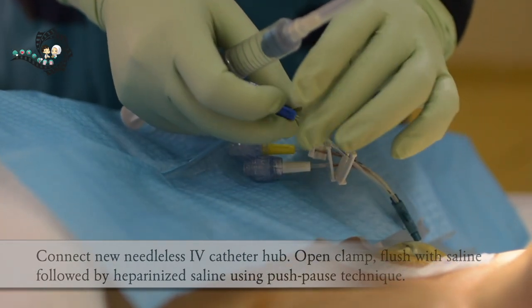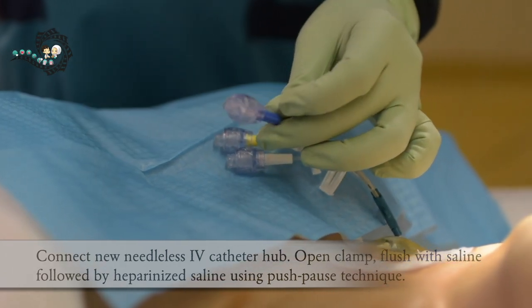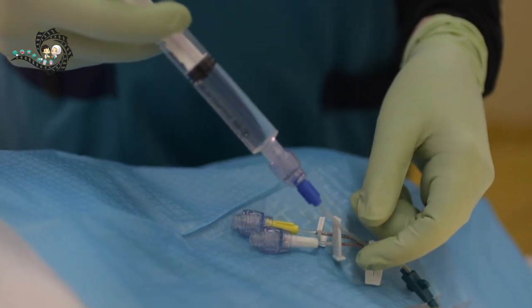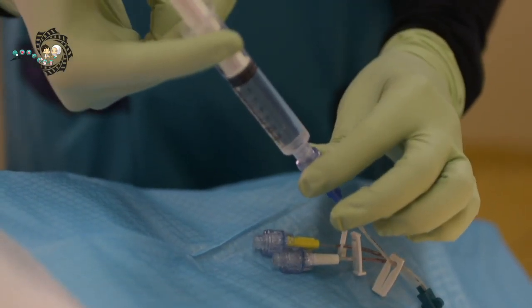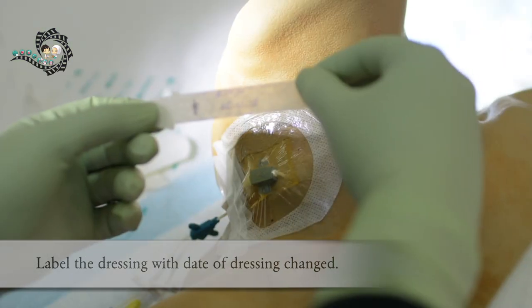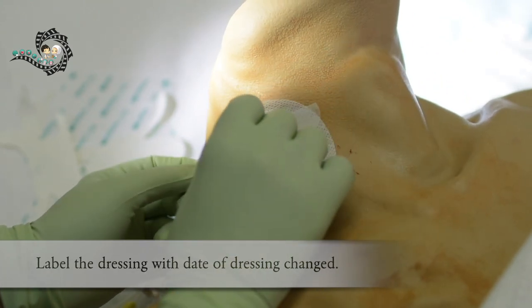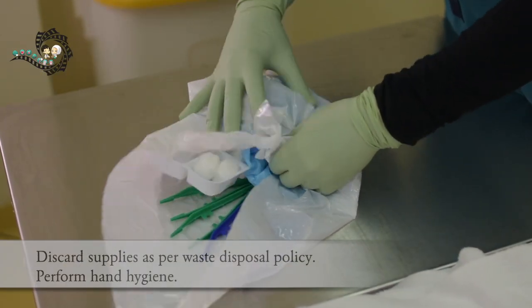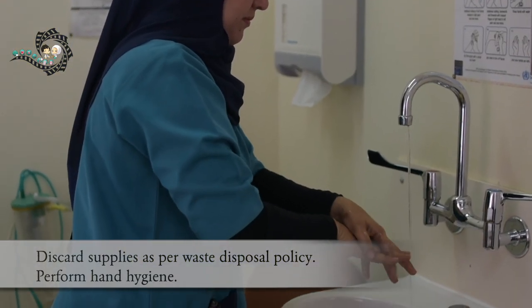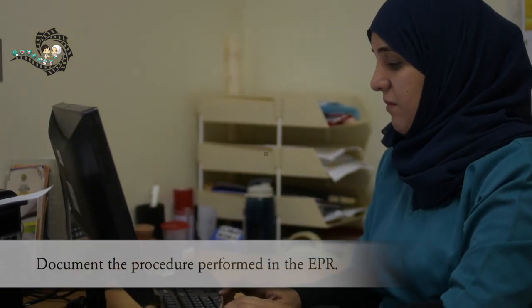Open the clamp, flush with saline followed by heparinized saline using the push-pause technique to maintain a patent catheter for intermittent use and prevent rupture of the catheter. Label the dressing with the date of dressing change to ensure the dressing will be changed at the appropriate date. Discard supplies as per waste disposal policy. Perform hand hygiene after the procedure. Document the procedure performed in the EPR.